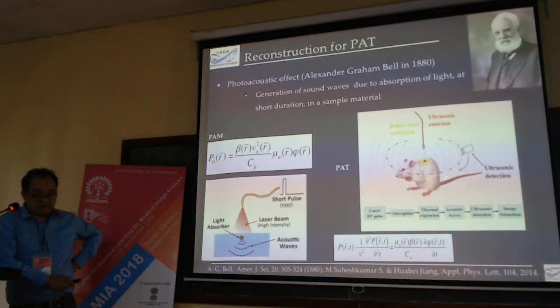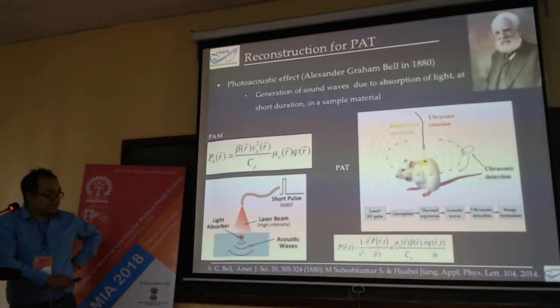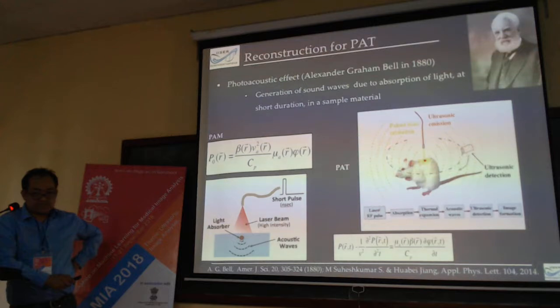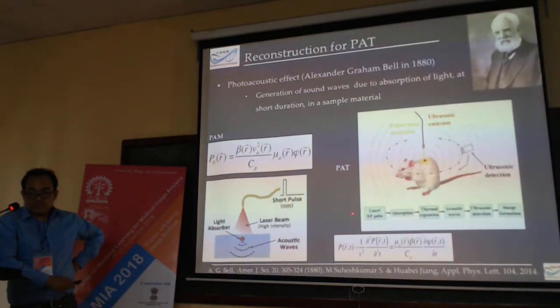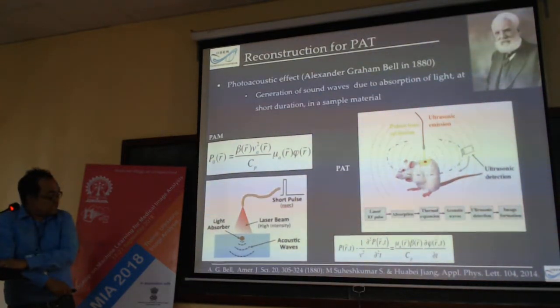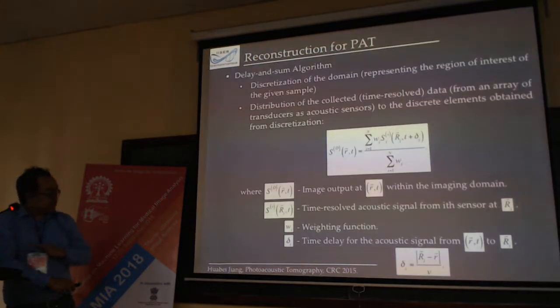So instead, in the instrumentation, if we keep an array of detectors, we can detect all of the signal around the sample at one time. That is also different. However, this is not real time, although people try to do it in real time by increasing the expenditure of the systems.